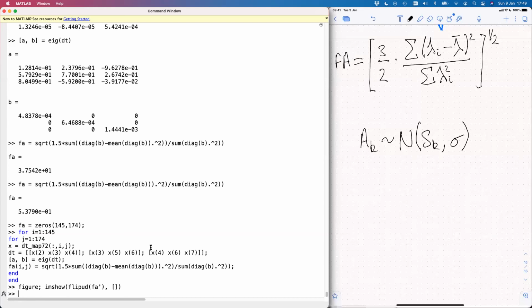But of course, we did something slightly unusual, which was before doing the linear least squares, we took the log of all of the measurements. And so the question arises, well, if this assumption is reasonable for the measurements, is it reasonable for the log measurements? So let's have a think about that.